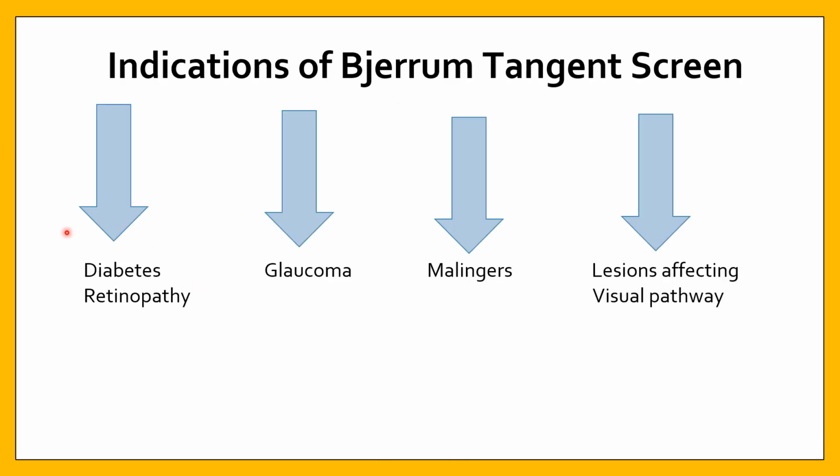Bjerrum's screen can be used in diabetic retinopathy, glaucoma, malingerers, and lesions affecting the visual pathways.